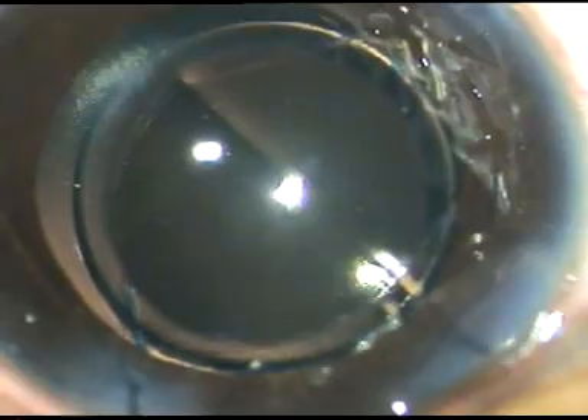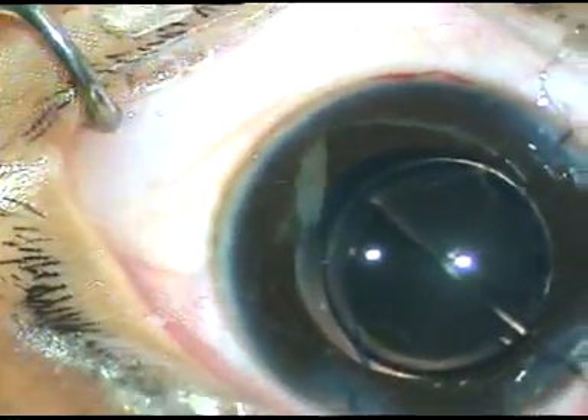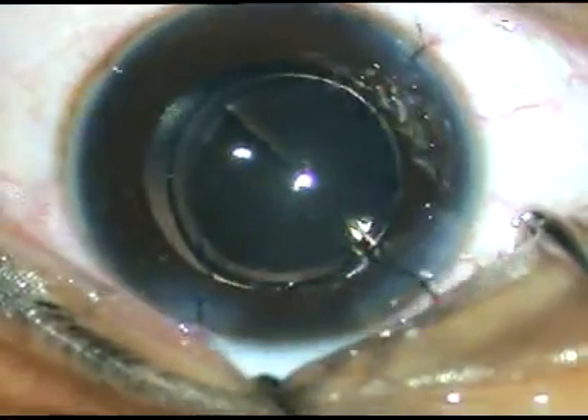Then I placed some releasable sutures to the wound and concluded the case. I hope this video will help you in your practice. Thank you for your attention.